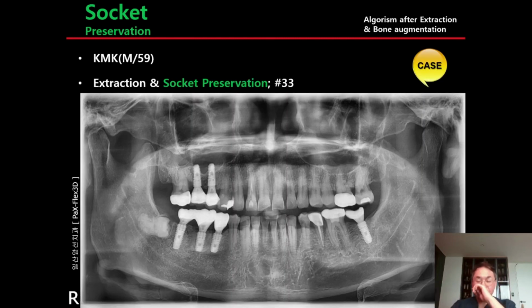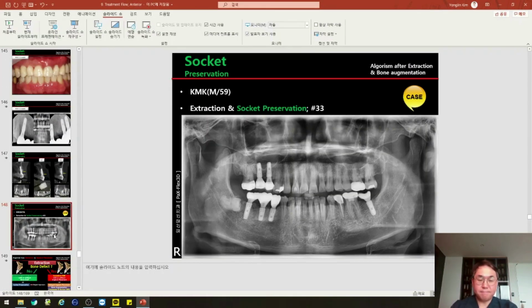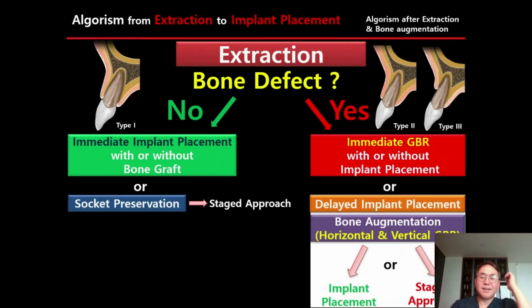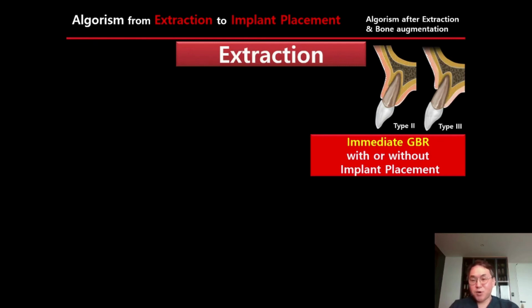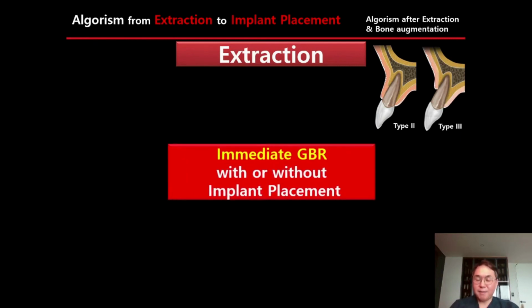Here, sorry, I will skip this. Sorry, I skipped this area. And until now, we talked about immediate implant placement and socket preservation. But let's move on to type 2 socket or type 3 socket.